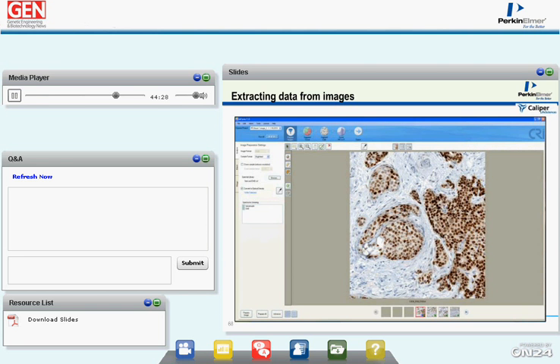So the next slides are about Inform image analysis software. This is the software that Mike Feldman talked about. Here's a screenshot of the interface of Inform. It provides a flexible workspace where you can load in images, essentially any number of images you'd like. These images should be selected to be representative of the kinds of images you'd like to process. And in this case, this is a breast cancer tissue section. It's been labeled with hematoxylin and a progesterone receptor, DAB immunohistochemistry.